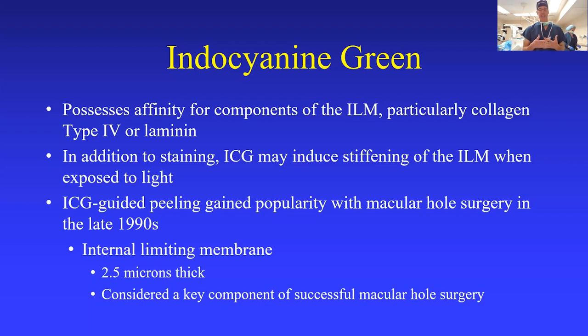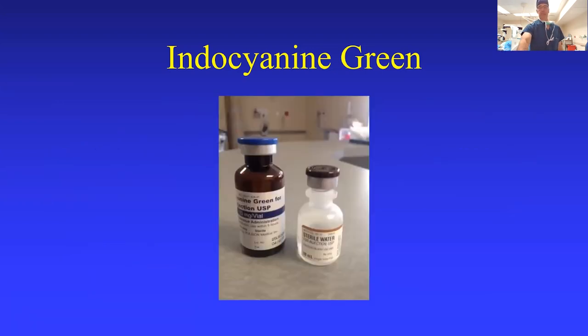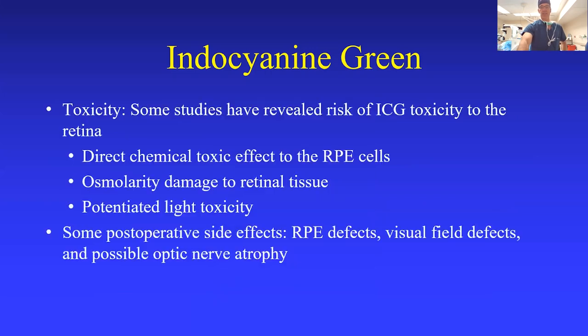I've heard the smallest structure or thinnest structure removed surgically anywhere in the body. So to do it when it's clear and not really visible is a whole other level of talent that I think you're much safer and it's more effective if you can stain it. And there's the IC green that we use.